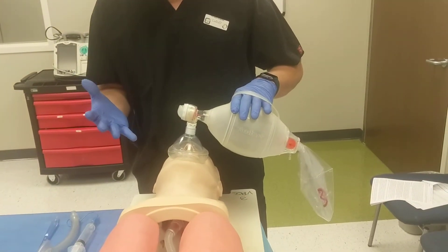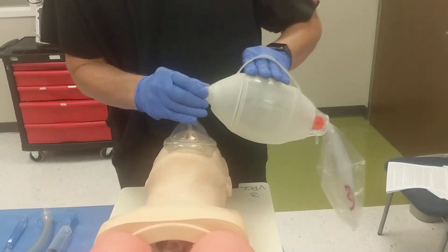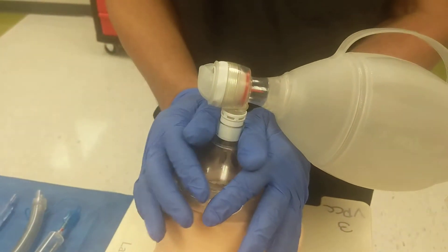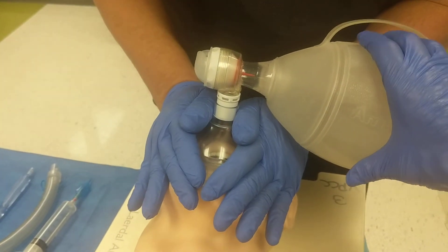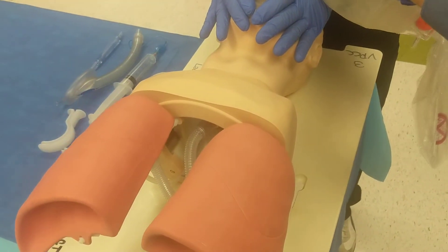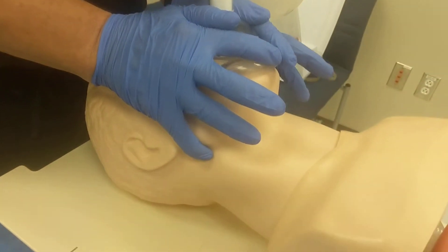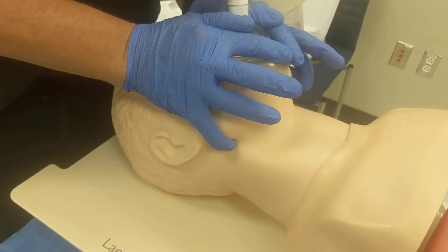If you have a very difficult patient to ventilate and you have the benefit of an assistant, you can use a two-hand technique. Take your thumbs and put them directly against the nozzle, make sure your thenar eminences are on the apex of the mask and your index fingers are on the bottom of the mask. Roll your hands down and literally wrap the mask around the patient's face and push straight down — you'll have a fantastic seal even in the largest of patients. If your hands are big enough and the patient has sonorous breathing, you can attempt a jaw thrust with your fifth and fourth fingers, though it's very difficult especially in a large, heavy patient.